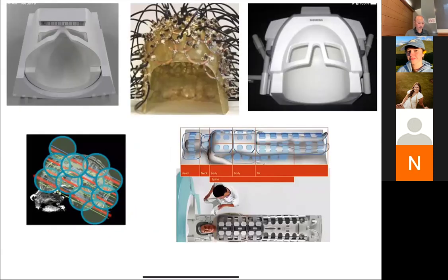Okay, so the next step in the story was in the 90s, when people started experimenting with what happens if you didn't have just one coil?